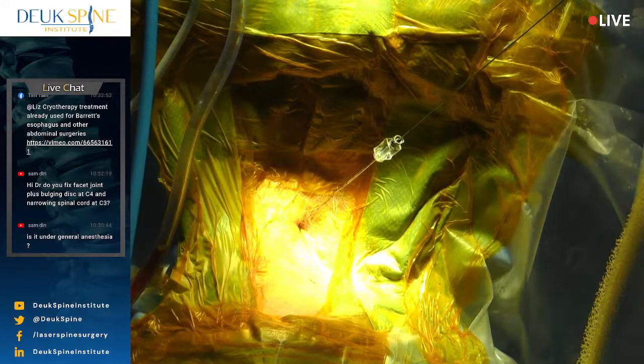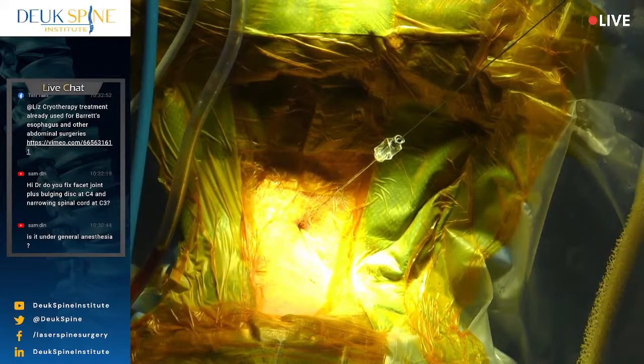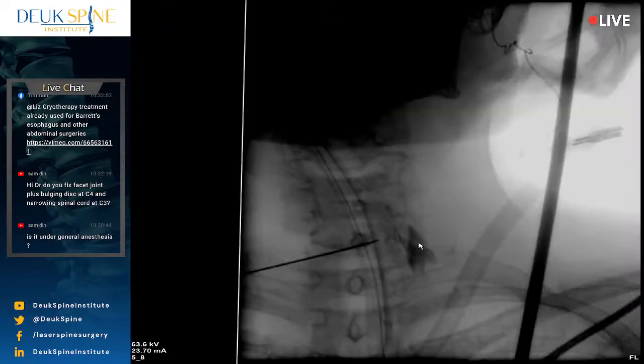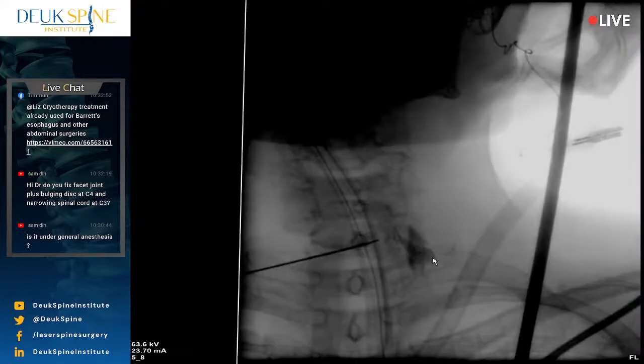Up a little more. Down a little bit. No, to the left. Left, left. There. Now trace it out. It's like a long trunk. Another way. Yeah, right there. Go, go, go. All the way down and out. Yes. Keep going through that dark area, the trapezoid. And there it is right there. So it runs behind the trapezoid. That is the nerve root.